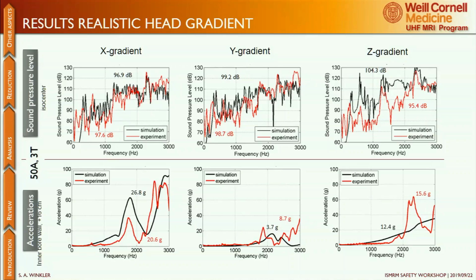There's probably a little more room for improvement for vibrational response. You can probably add the scanner and other important features, but it seems as though they're not so important for the final sound pressure levels. So some observations also in terms of comparing body to head gradient inserts in terms of acoustics.